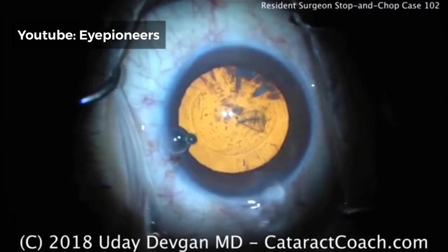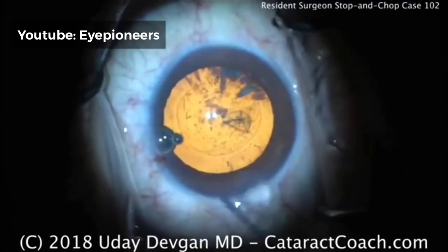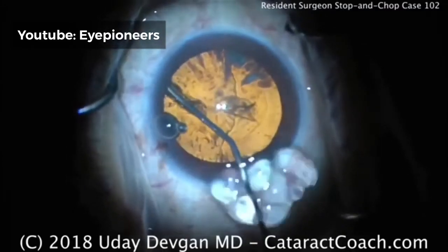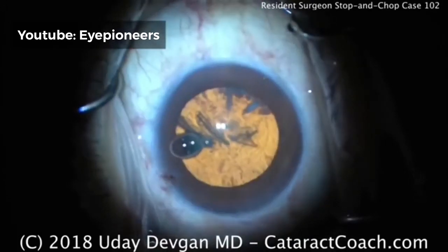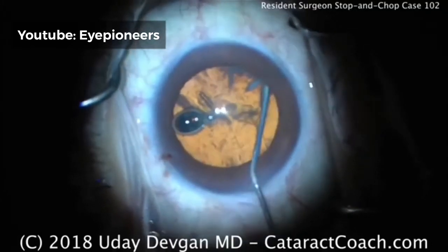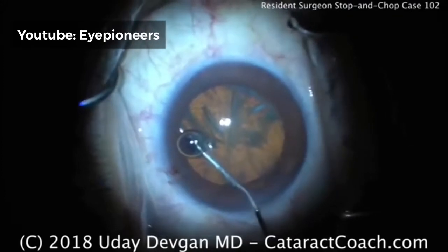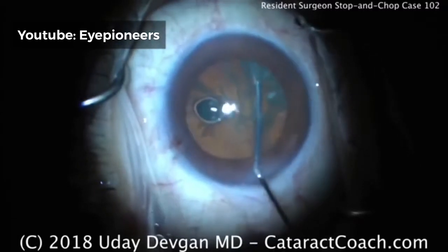Now it's time for some hydrodissection. Watch the incision carefully because you'll see how much viscoelastic we're going to lose — and that's normal for a cohesive. There's the cannula; good fluid wave coming across. Look at all that viscoelastic coming out of the eye. At this point there's almost no viscoelastic left in the eye, and certainly the corneal endothelium is not very well protected. This is why I encourage you to put some dispersive viscoelastic to protect the endothelium prior to putting the phaco probe in the eye. Good hydrodissection with multiple waves — this should rotate quite easily.